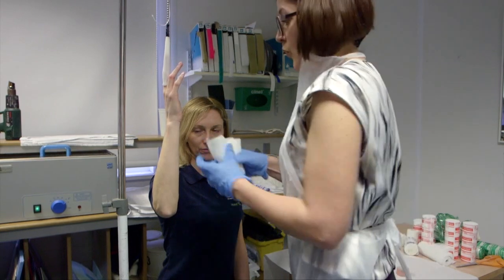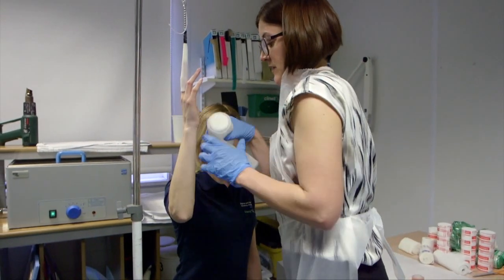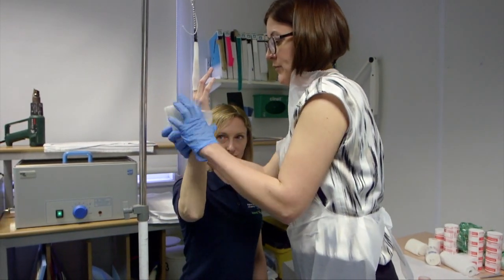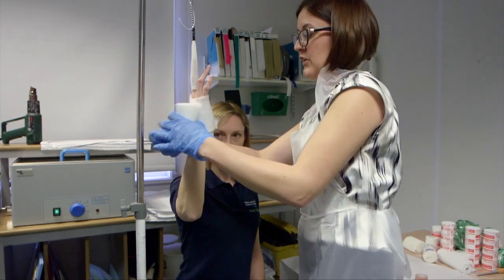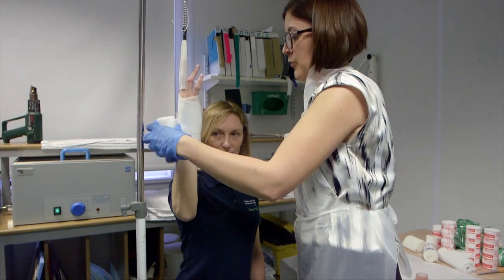The advantage is that one person can apply the plaster without assistance, which is very different when manipulation is performed. Also, the patient doesn't need any additional pain relief, as the traction itself will help with pain relief.